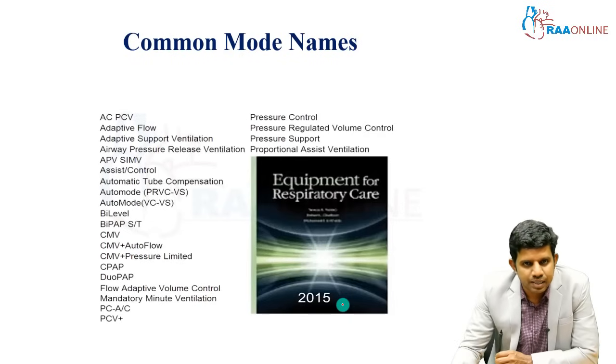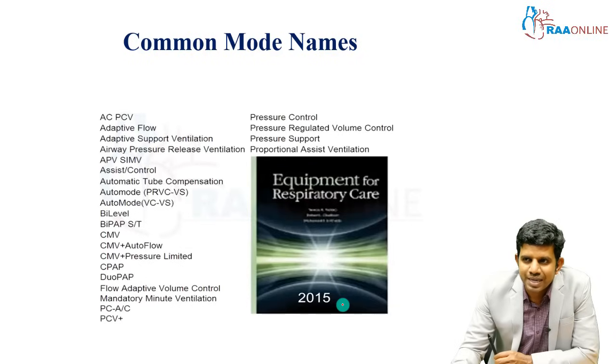First step is selecting the appropriate mode. But what is the mode of mechanical ventilation? There are multiple problems with this. More than 250 modes are available in ventilators, which is a problem. The second problem is that each manufacturer gives different names, so it's very confusing. The name does not actually express the actual behavior of the mode.